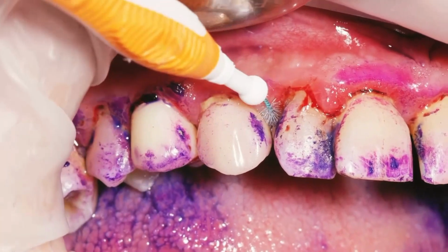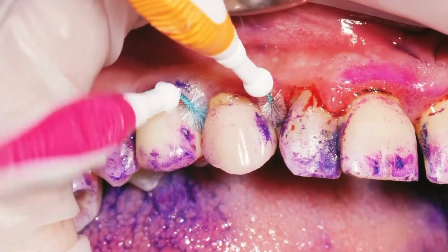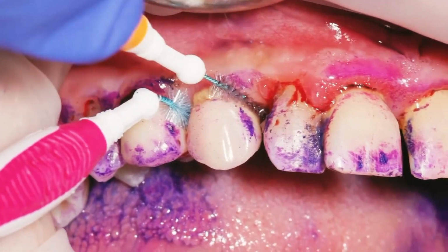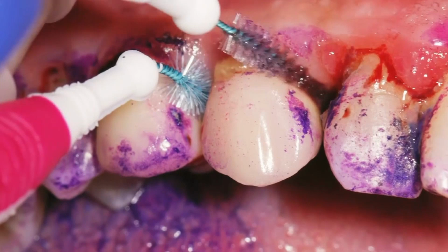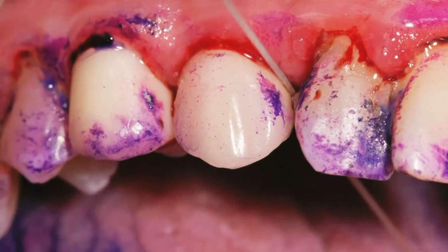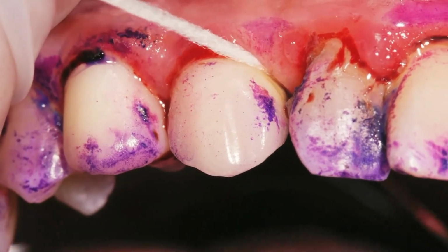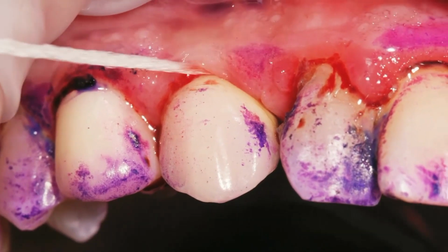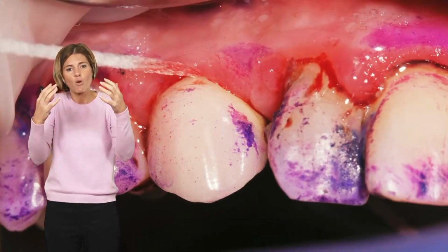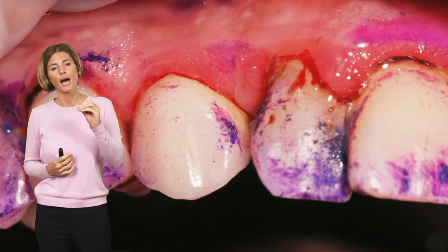And then we started explaining how to use the interdental brushes, different colors, different sizes, especially where he has the implants, because we need to clean the transmucosal part going into the sulcus, not only with the interdental brush but also with the floss, because the floss, as you can see here, can go directly into the sulcus and can hug the crown and the abutment of the implants, obtaining a very high quality of cleaning.